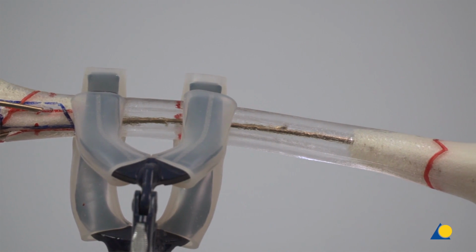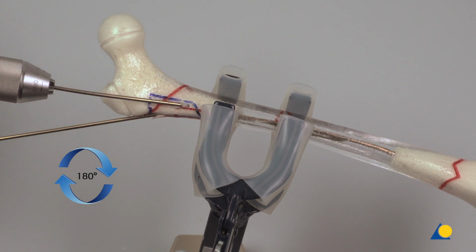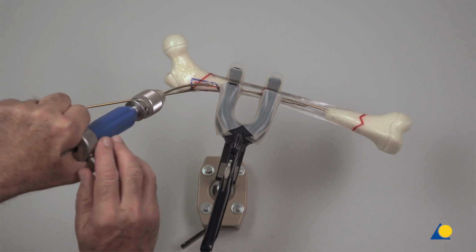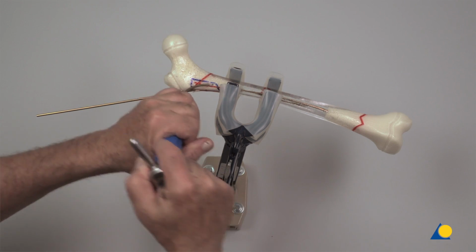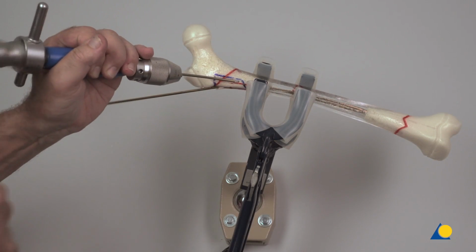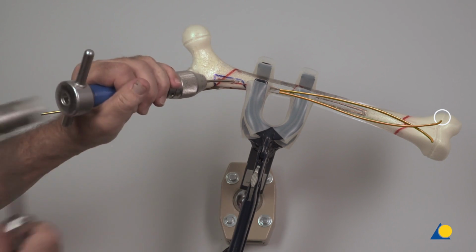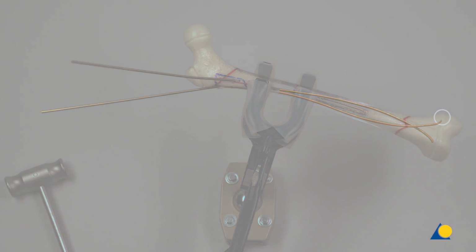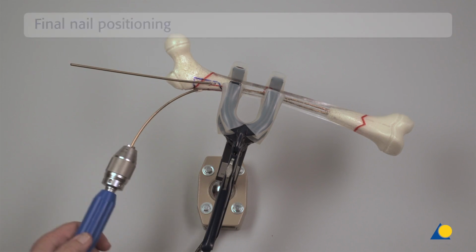In this position, the nail must be rotated 180 degrees clockwise or counterclockwise depending on its relation to the first nail. And the external part of the nail is bent in a distal direction of nearly 90 degrees, creating an S shape which will provide the necessary inner contact with the lateral cortex at the fracture site and the medial cortex of the proximal femur. The nail is placed in the correct position and advanced into the distal metaphysis respective to the condylar region. The inserter is removed. The nail is further bent to increase pressure against the cortex and provide optimum stability.